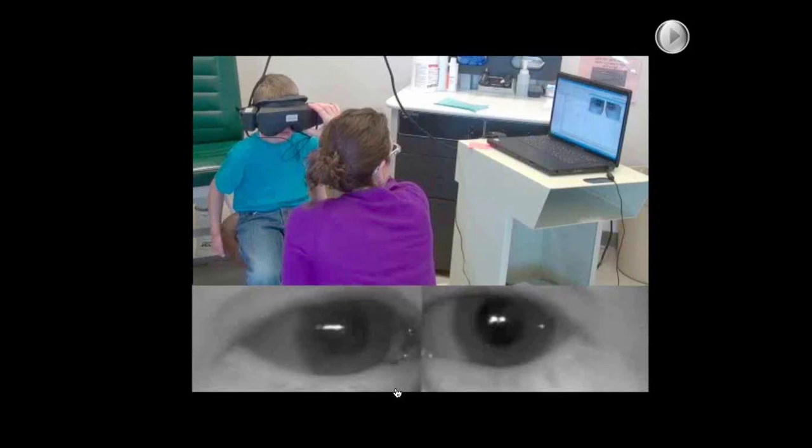We talk about night vision goggles and a spy test or a princess test, depending on what it is we're doing, in order to be able to get the goggles on. And you really have to communicate with children throughout this type of testing so that they know they're okay. You can also put them on the parent's lap, just as you would in a rotary chair, and this allows you to test in clinic without the need for a rotary chair easily whether or not there's the presence or absence of per-rotatory and post-rotatory nystagmus.